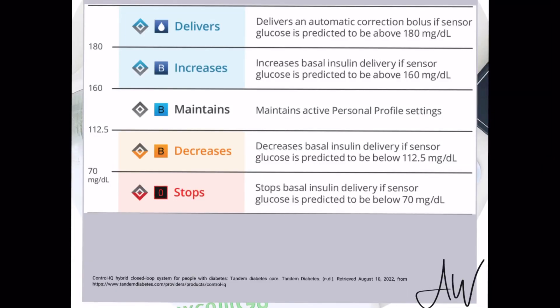With Control IQ, the pump isn't looking at where your blood sugar is right now, but where it's predicted to go in the next 30 minutes. So if you're predicted to stay between 112.5 and 160, the pump is going to use your program basal until you're going too high or too low. If you're staying between 112.5 and 160 all day, it would just use your program basal. When you're using the program basal, you'll see a regular gray diamond in the upper left-hand corner, which also tells you that Control IQ is on.